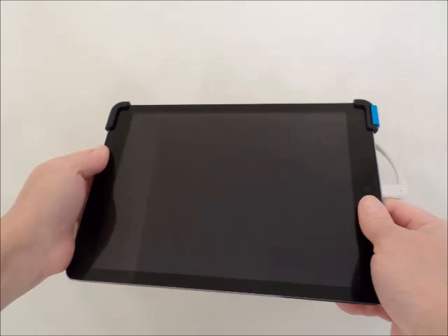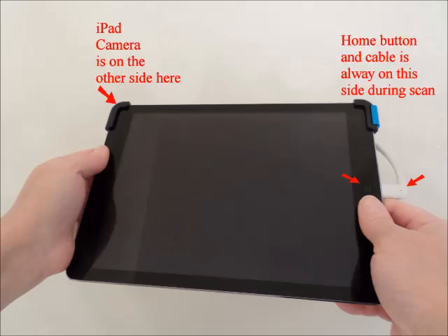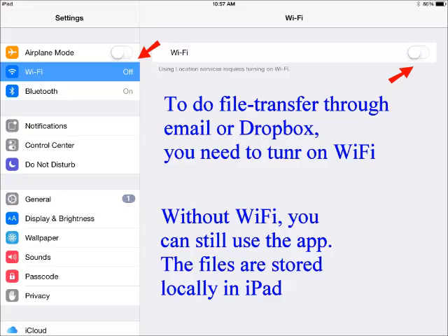The way to hold the iPad with the sensor is shown here. The iPad camera is on the upper left hand side. The home button and the cable should be always on the right hand side during the scanning process. After turning on the iPad, you need to enable the Wi-Fi and the camera in the settings.